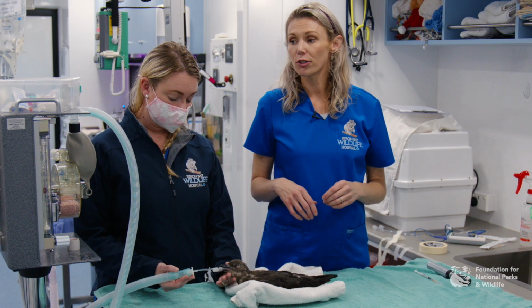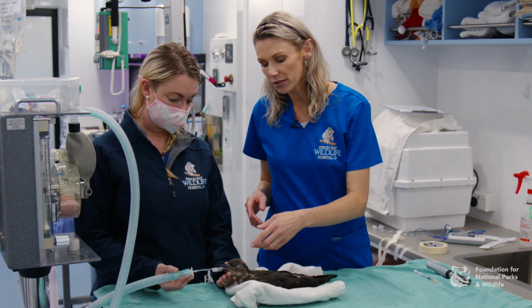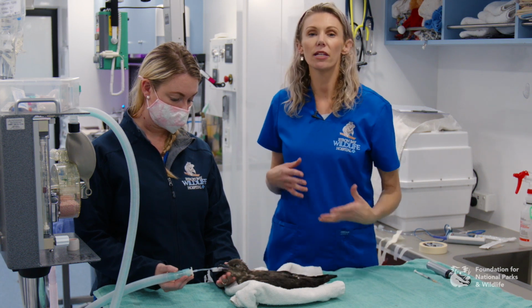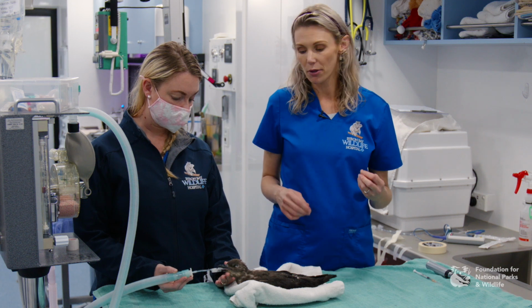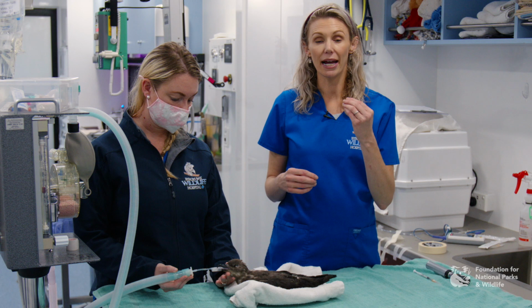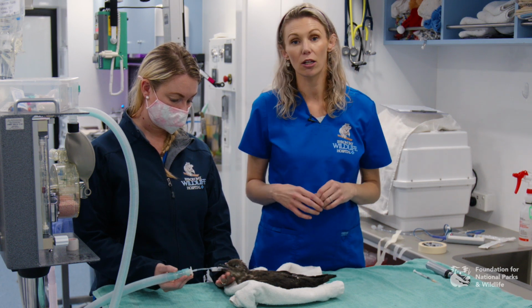Turn off your isoflurane, flush out your system so that you've got fresh oxygen, and then monitor them for fluttering of the eyes and shaking of the body. And that will give you an indication that they're about to wake up. You don't want to keep the tube in there too long in case they do bite it and they cause irritation, especially to that little projection in the glottis.